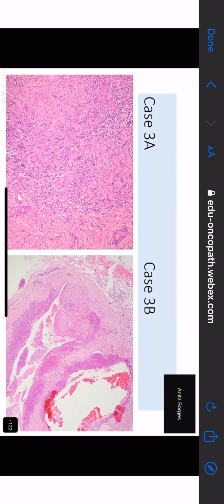On the left-hand side, what do you see? It's spindle cells, arranged in ovoid cells. Some have pale eosinophilic cytoplasm and some appear to have clear cytoplasm. Excellent. Very good. Yes, Vimy. And the arrangement of the spindle cells is in? There are fascicles. So the spindle cells are in fascicles.